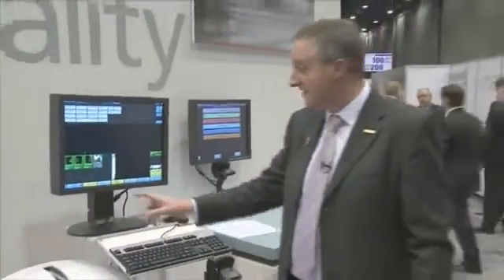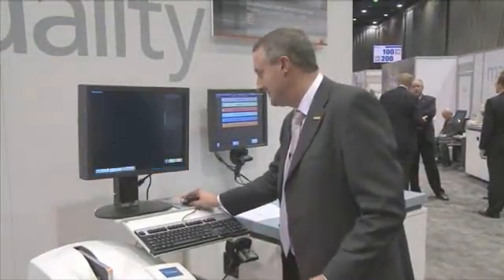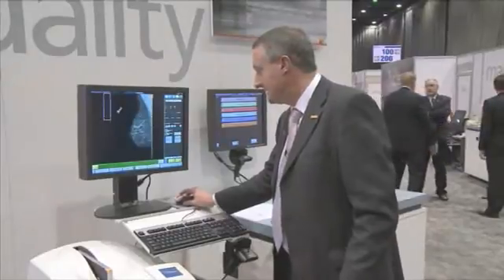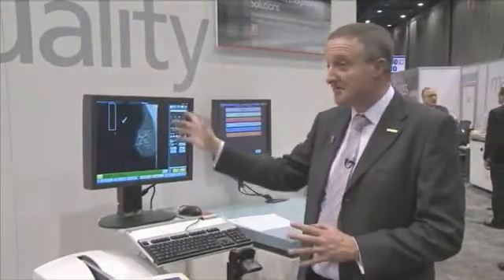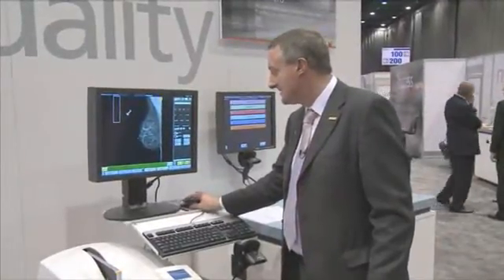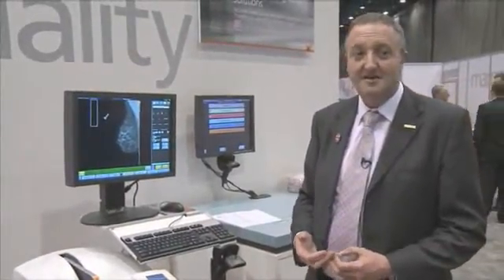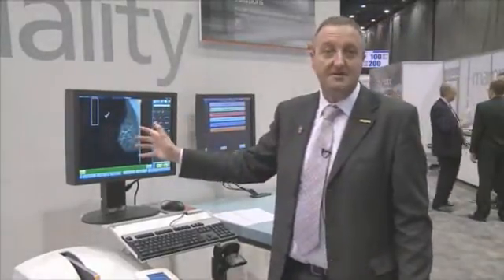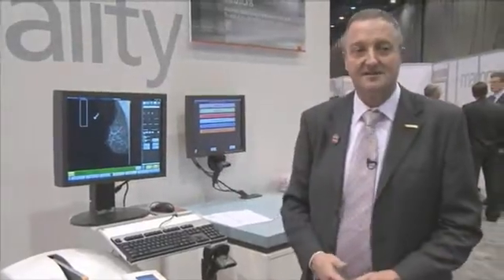While it's doing that, you can look at the previous view which we have already prepared here. This particular monitor is a three megapixel monitor, which is sufficient resolution for the radiographer to see what they need to see to make sure they position the patient correctly. Nine times out of ten, all they do is just press accept and the image goes straight to the PACS system. They can add annotations to the image if they want to, but normally they wouldn't require to do that — they just press accept and it goes straight through to the PACS system.